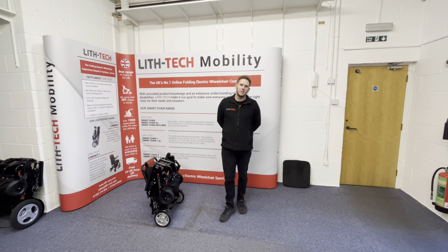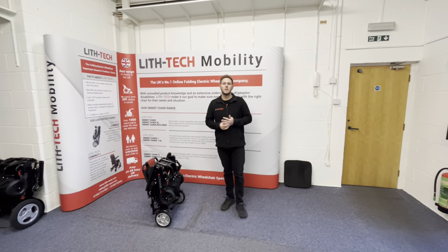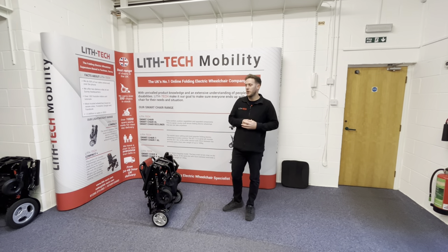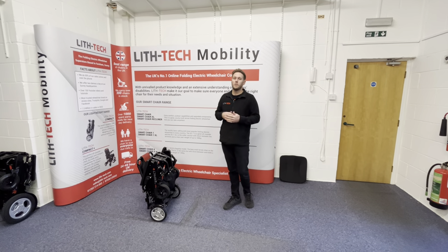Hi, this is Toby from LITH-TECH Mobility. In today's video we're going to be introducing our new Compact Plus. So it's 2023 and we've decided we're going to do things slightly differently. We're going to add a new chair and remove a few chairs from the range. It's now going to be our Compact and our Compact Plus in our lightweight chairs range, and then we're going to our smart chair range.